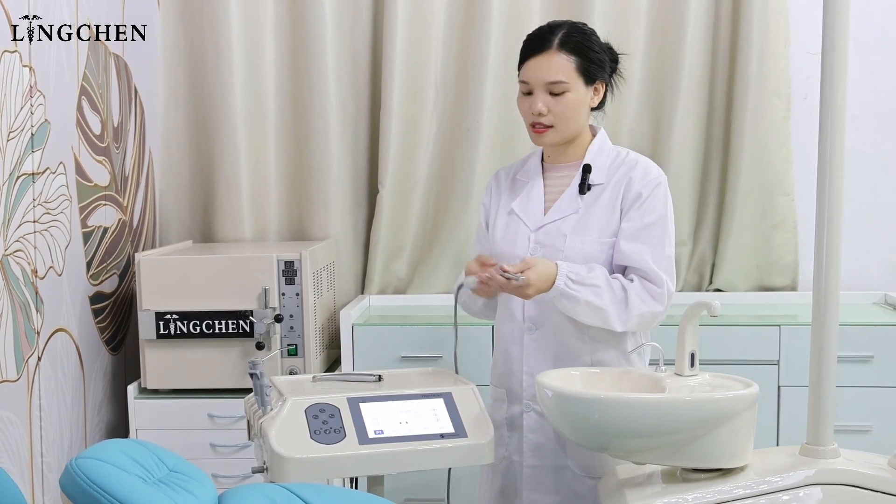There are two water bottles. One is for the implant motor, where you can put saline water.